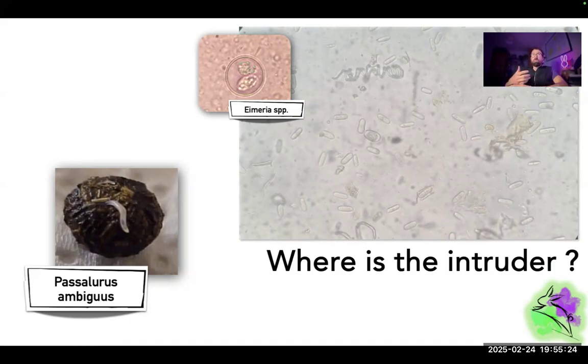Differently from what we might think in a dog or cat, where with parasites the dog can show diarrhea or feces that don't look normal, in rabbits the feces can also be completely normal. Like in this case, you see a normal fecal pellet, perfectly rounded, nice sides, but with the worm coming out. Also in this case, it's very, very important to have the feces of your rabbit checked at least once a year.